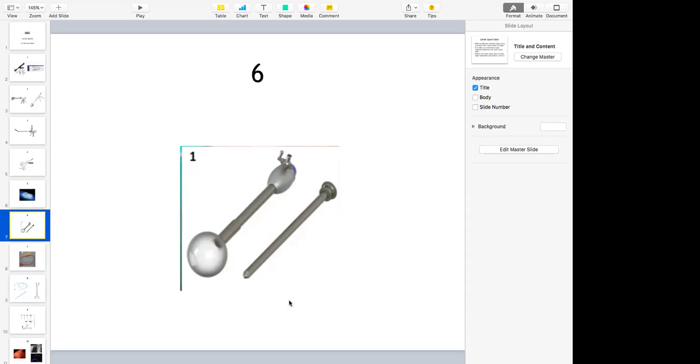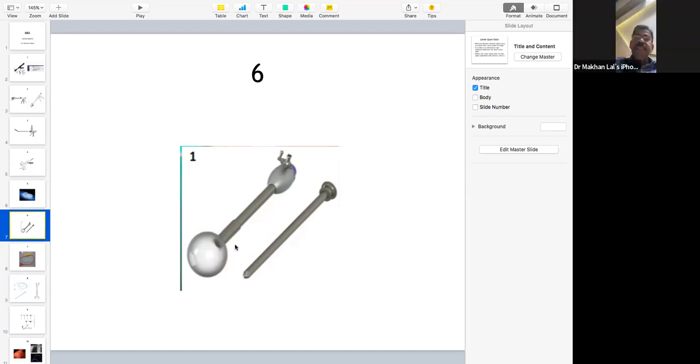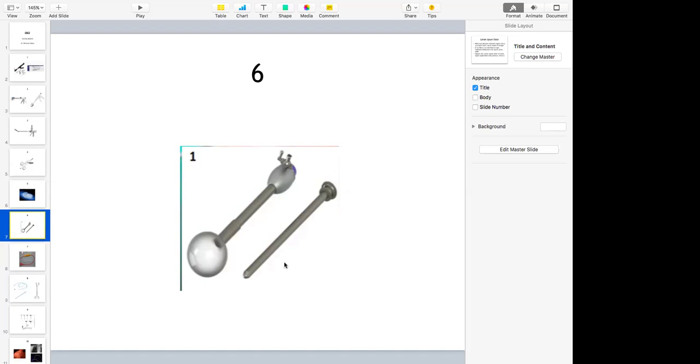Is it an optical trocar? No. OptiView has the entire transparent lens material. This is metal. This is the balloon trocar and cannula. Next, in which operation have you seen this being used? Totally extraperitoneal mesh repair in cases of inguinal hernia.